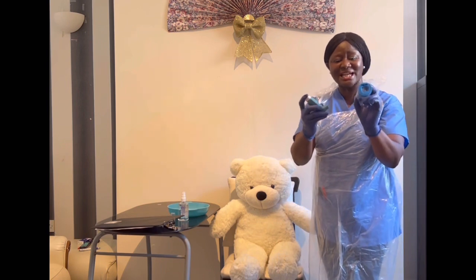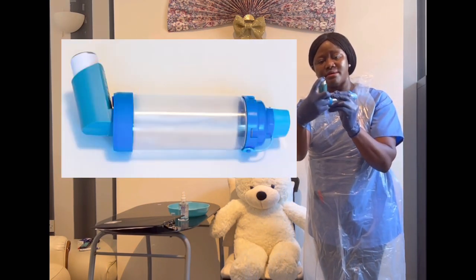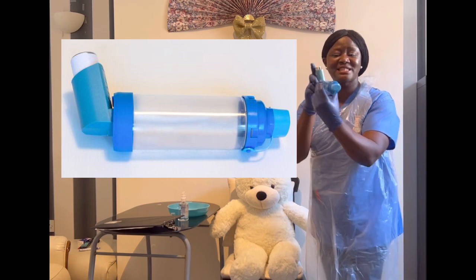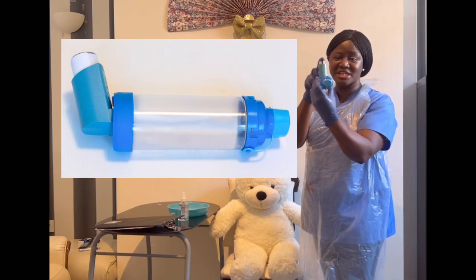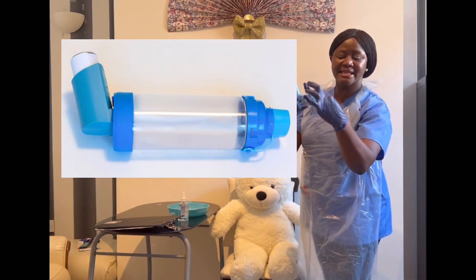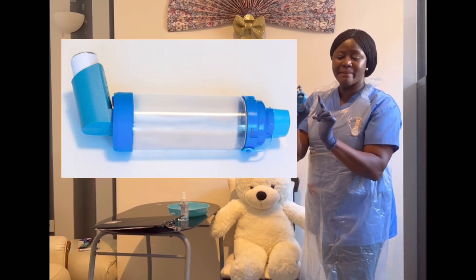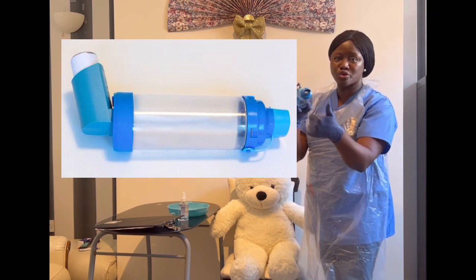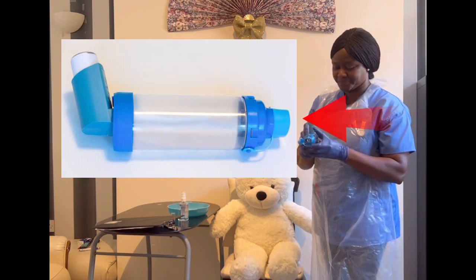I'm going to insert it right in with the spacer device, and it's this way, not this way. Note it, this way is the correct way to do that. I'm removing the mouth cap of the spacer device as well, and I'm careful not to contaminate the spacer device mouthpiece.